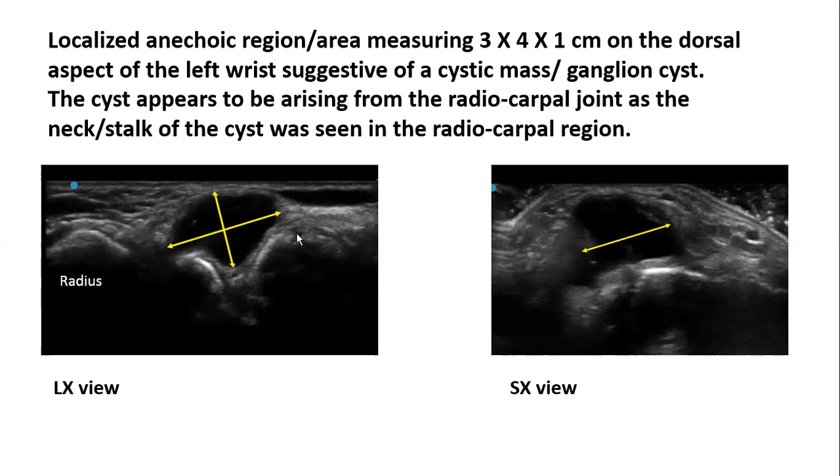So if you are differentiating cyst from solid, you can compress, do a little sonopalpation, and if you can displace the fluid or compress it a little bit, it's more cystic versus solid, which you cannot compress much. But there are certain exceptions, especially like ganglion cyst on the dorsum of the wrist. There's a lot of pressure in this cyst, so you may not be able to compress it much. For example, the suprapatellar bursa, you can compress it and move the fluid because it's a big cavity that communicates with the joint.